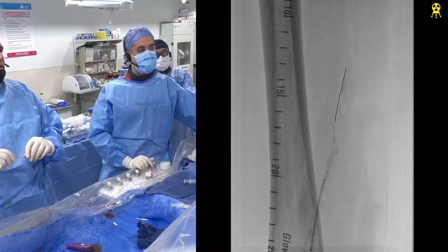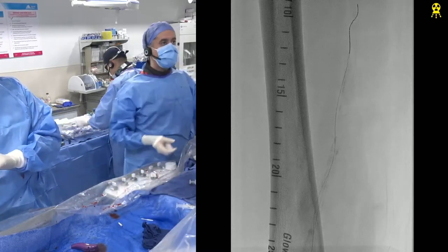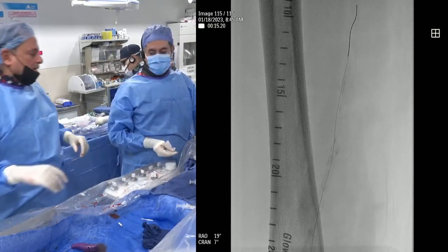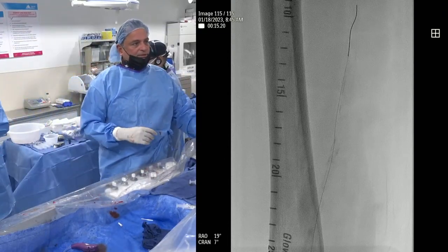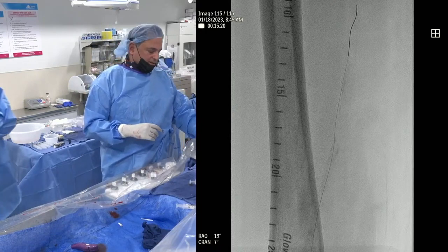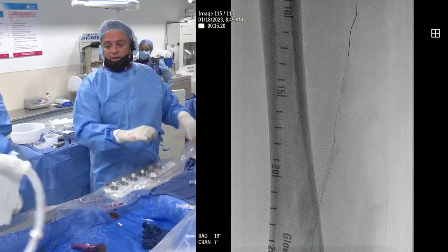So okay, let it sit there. That's a good spot. And the question is, where are you going to reenter here? Are you going to go as high up as the wire, or are you going to try to start back down? I mean, we could take a picture. We know the reconstitution's around 20, right? Is that right, brother? Around 20? So let's go around 20.